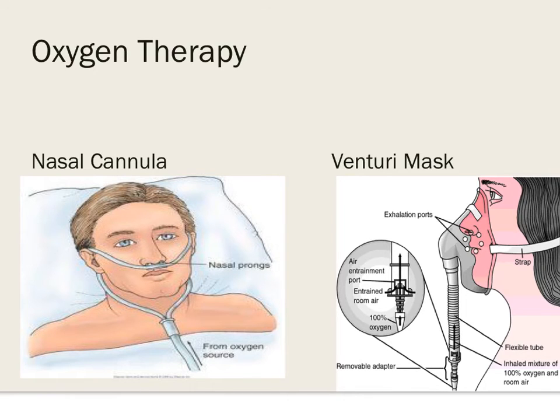Okay, the nasal cannula. Remember, for the nasal cannula that it can be set on a flow from 1 to 6 liters. So that means that we're going to set it between 1 to 6 liters. You're setting the O2 head between 1 to 6 liters. It certainly is an easy way and an inexpensive way to deliver oxygen. It makes it easy to eat and drink.